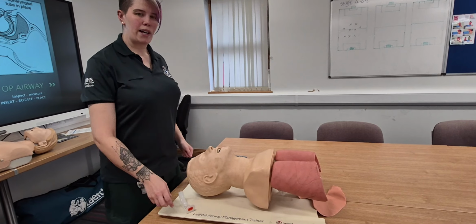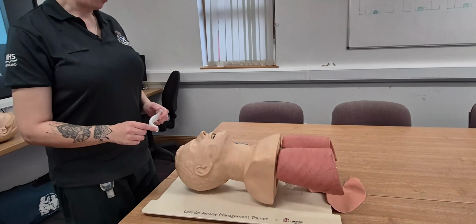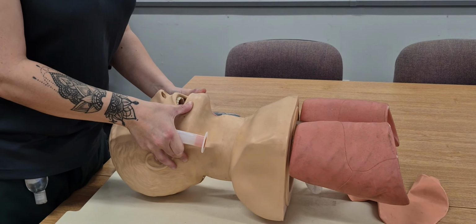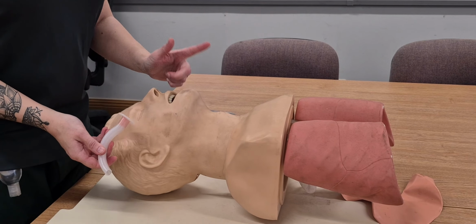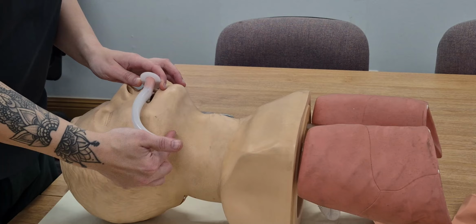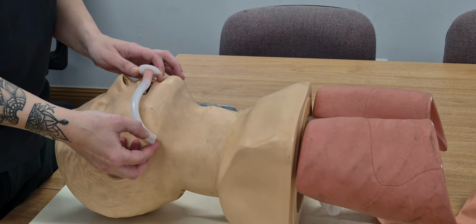So I'm justifying using my airway adjunct, which is an OP. I'm going to have a quick check just to make sure that they've not re-vomited again before I insert this OP. To measure it, I'm going to go from the middle of the incisors to the angle of the jaw, which is there. So this looks about right.